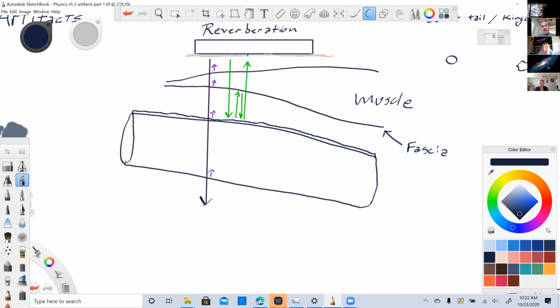And if it's bright enough, I'll see it again and again and again, just like with the Tupperware. So I might see an echogenic line running right down the middle of my carotid. Well, that's a little scary. Are we possibly looking at a dissection? Is that real tissue? Every time you see it, you'll become very accustomed to seeing it, but always take a second look. Make sure it's not a dissection.